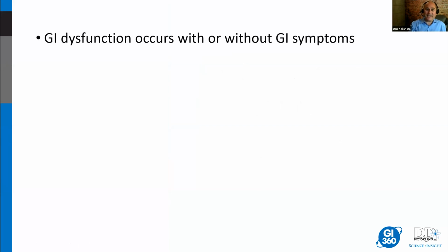And the complicated part about it is GI dysfunction can occur with or without GI symptoms. So when I teach at conferences, and I obviously can't do this right now because it's virtual, but at a typical conference, I'll say, okay, everyone in the audience, put your hand up if you believe that GI dysfunction can occur with or without GI symptoms. People put their hands up, and then I'll say, how many people in the audience believe that health begins in the colon and that if you're healthy in your gut, you're going to have all your other body systems working pretty well, and everybody puts their hand up. And I'll say, well, how many people run a GI test on every new patient? And it'd be like 2 people out of 50 will put their hands up. We don't act according to our beliefs.